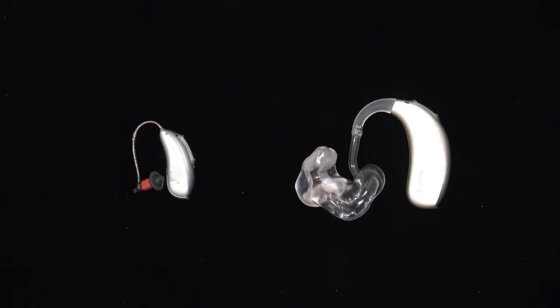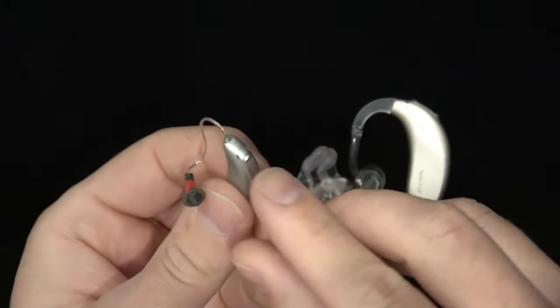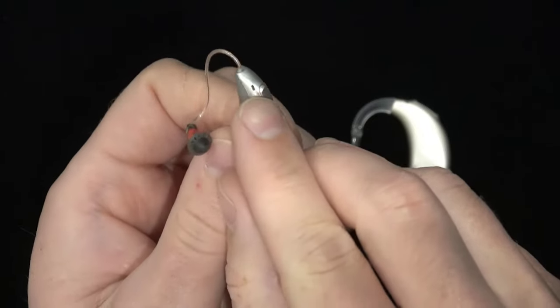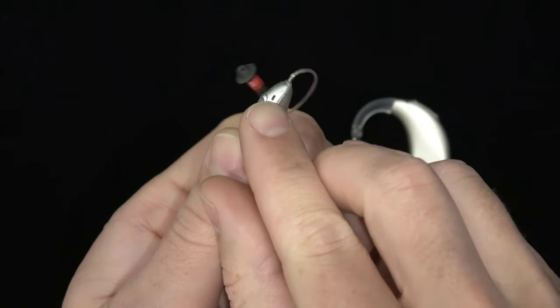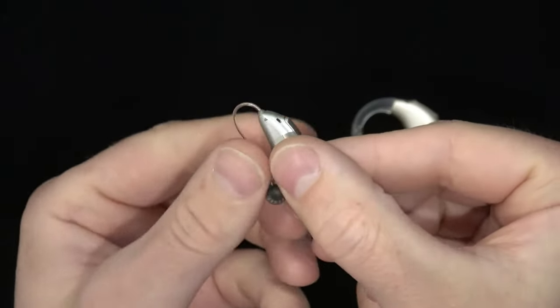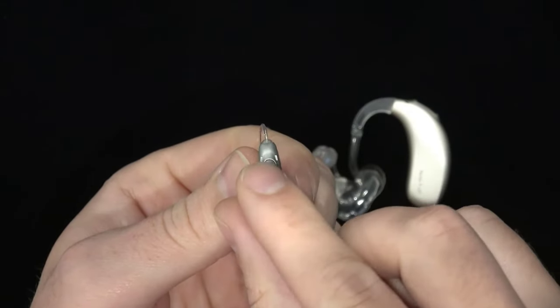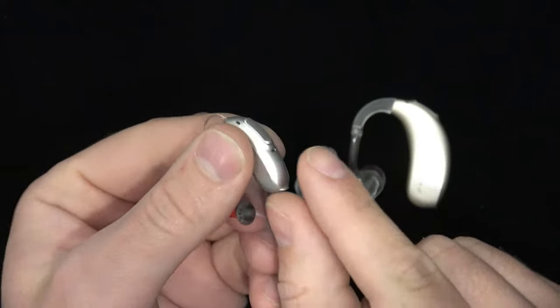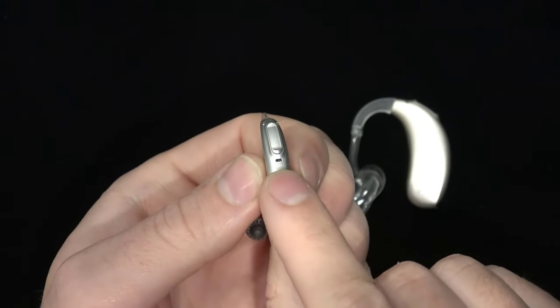Modern RICs and BTEs will often have two microphones, one facing forward and one facing backwards. The front-facing microphone will often have two ports or two openings towards the top and front of the device when worn on the ear, with one port being on the right and one on the left side. The back-facing microphone usually only has one port but can sometimes have two depending on the hearing aid.